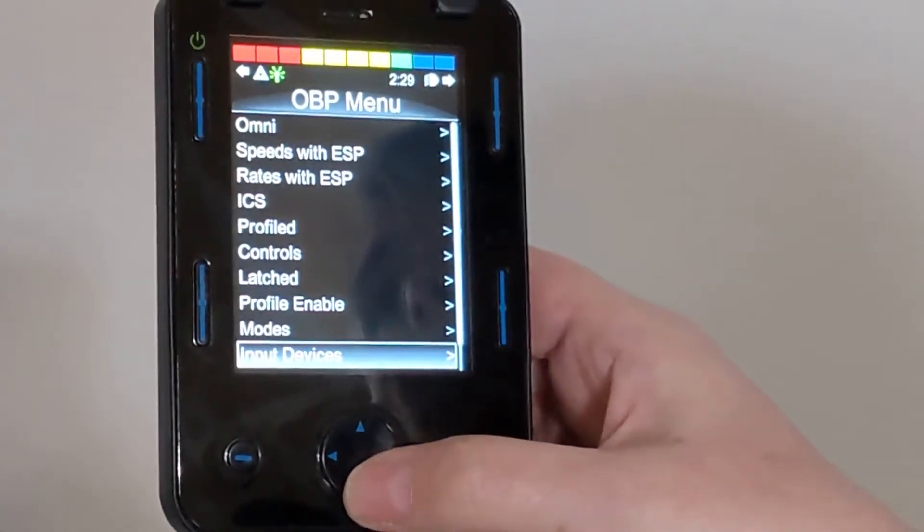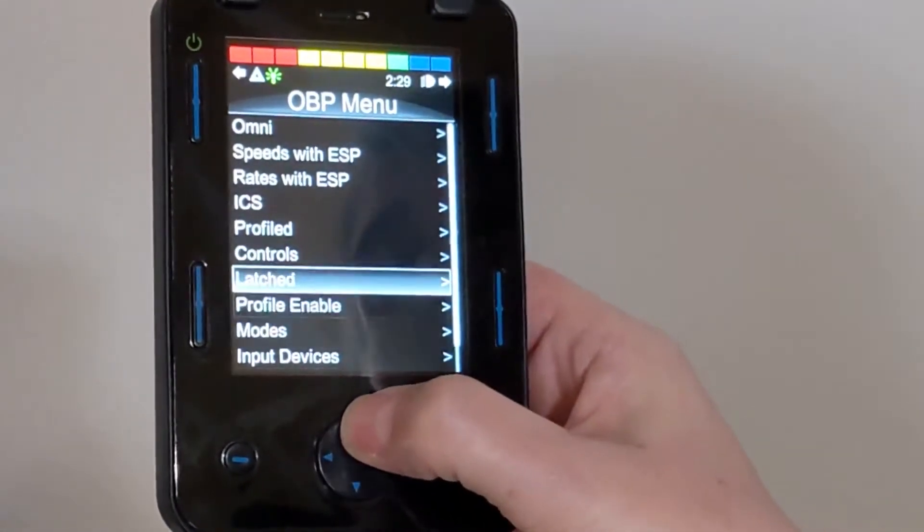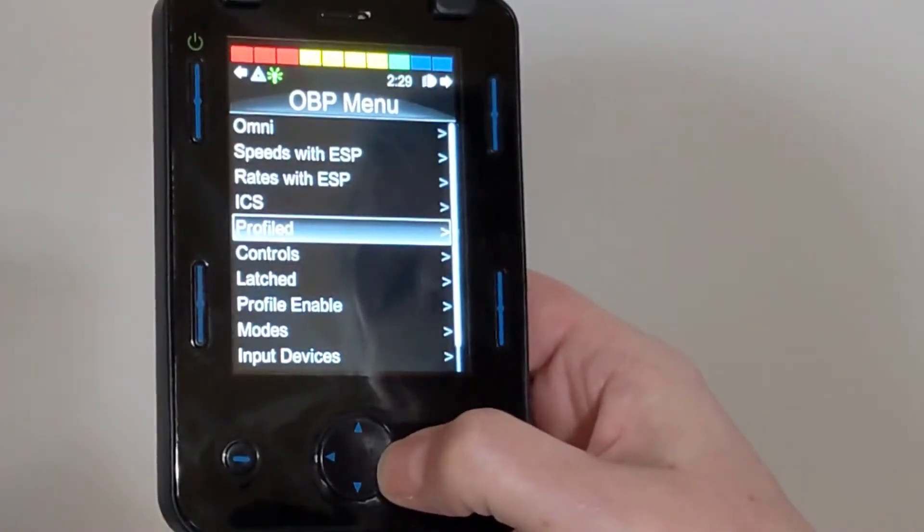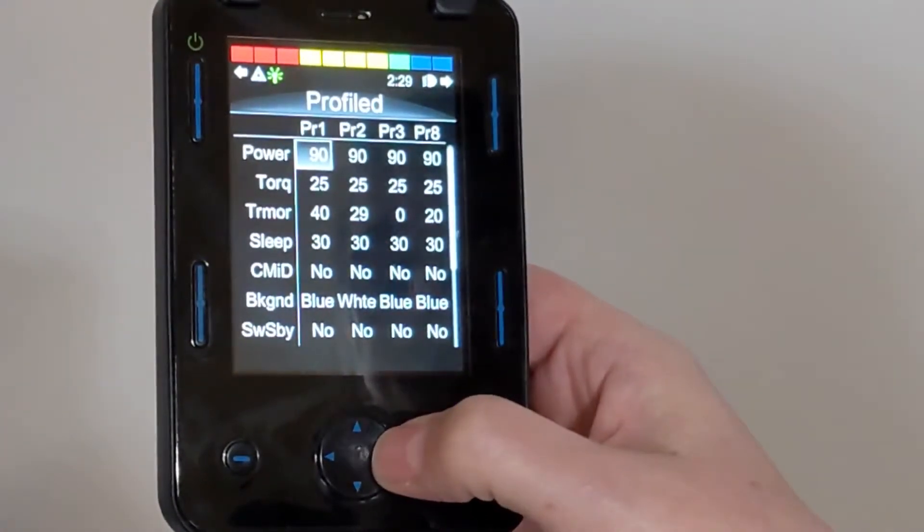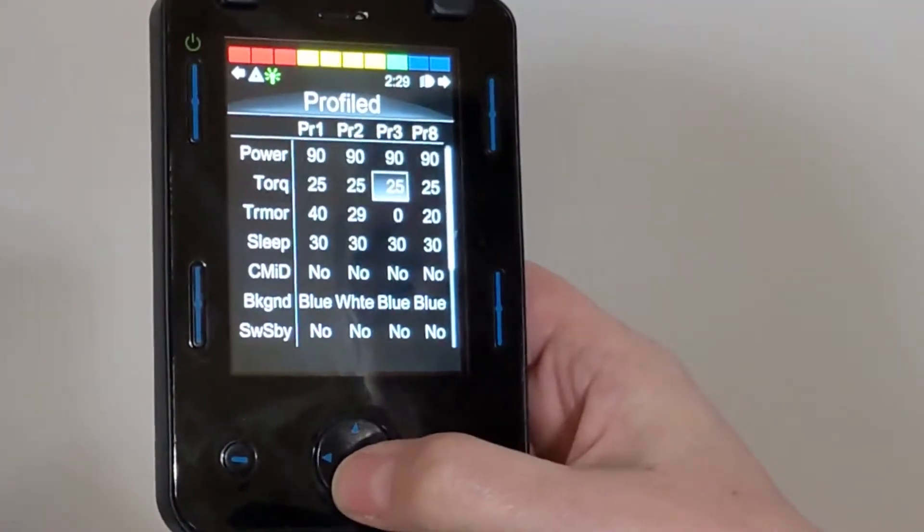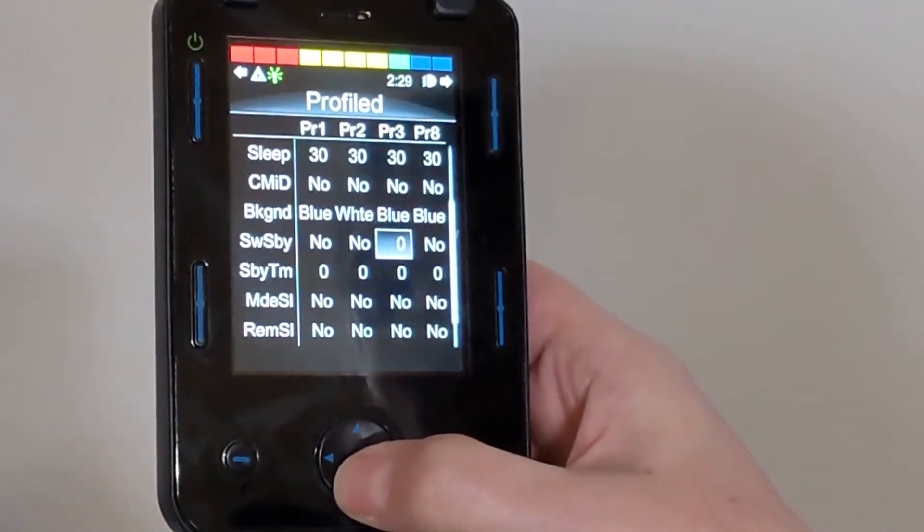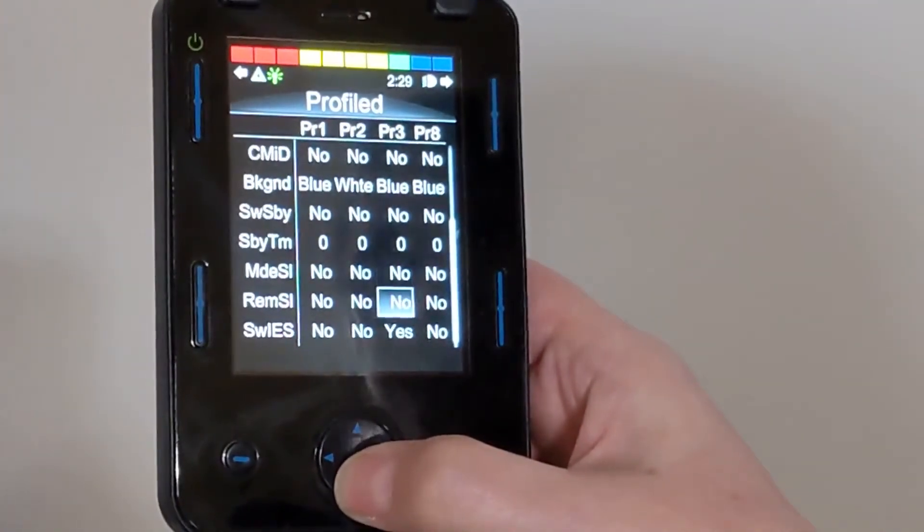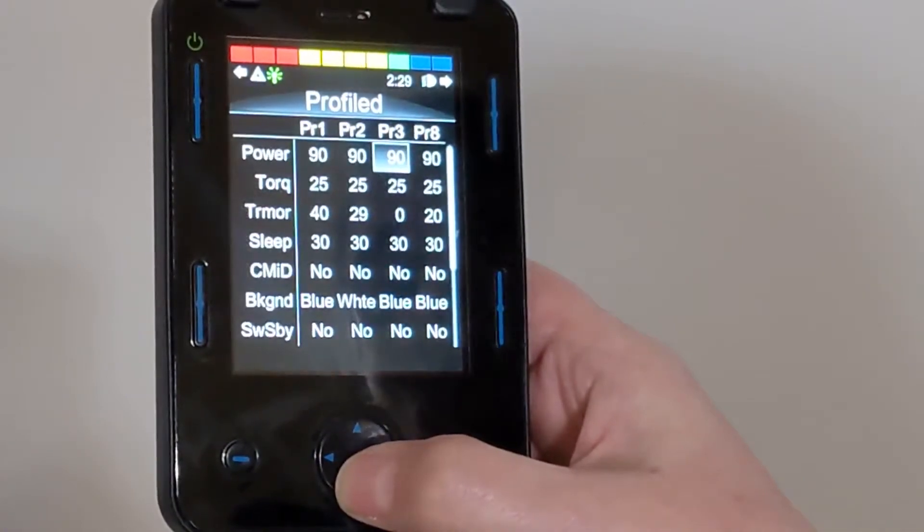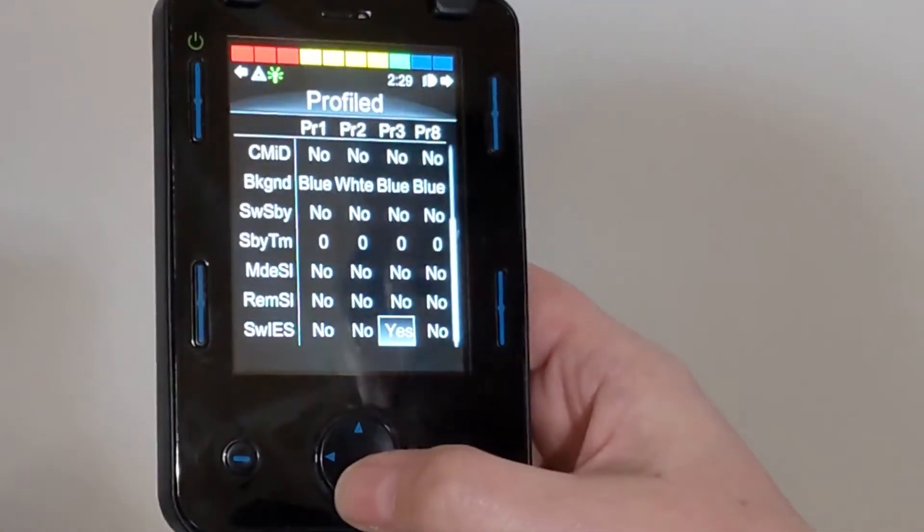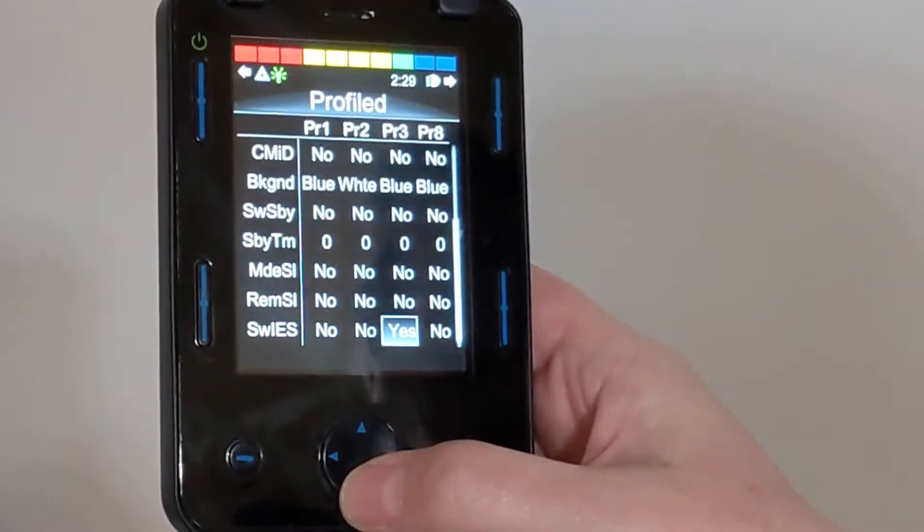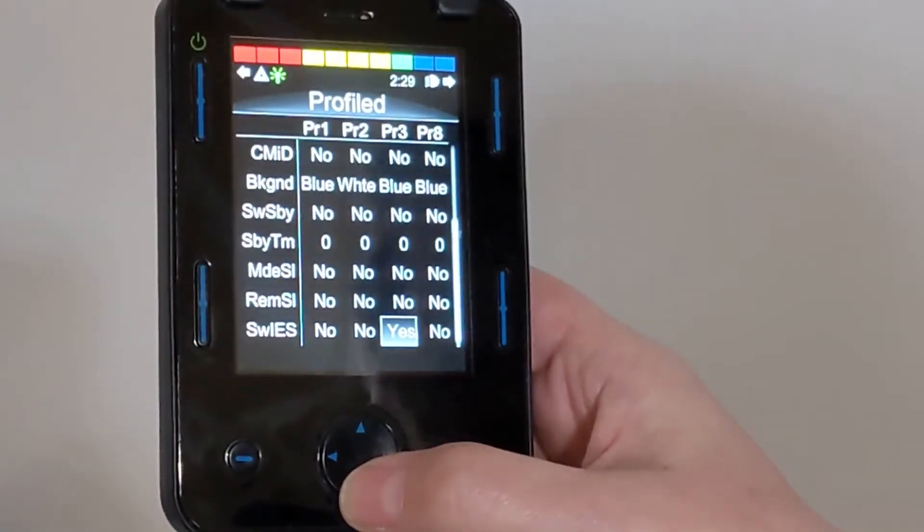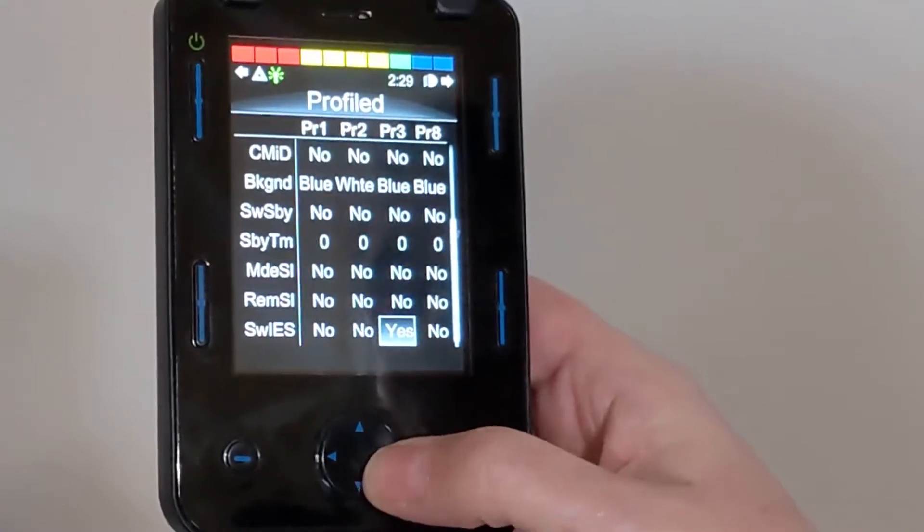Now we're going to go to Profile, and here we're going to go to Profile 3. Go all the way down to the bottom, and we're going to change SWIES, or Switch Input ESP, to Yes.